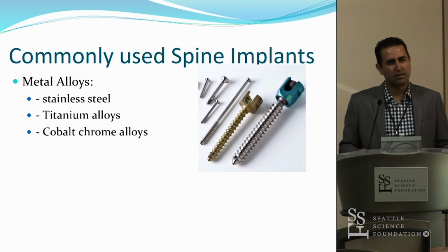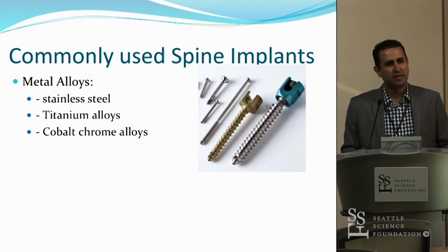One of the benefits of PEEK is that it can be penetrated by proton beams. So I skipped the level of the lesion as far as the pedicle screws were concerned, and instrumented above and below and put on PEEK rods, and that way they're not going to interfere.